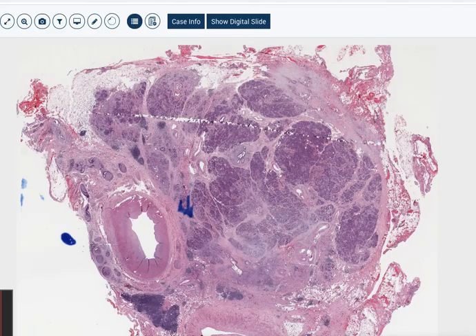So we're going to stick with the pancreas for a day or two. And here, as you can see, is a section of pancreas. We've got the splenic artery here, a nice thick-walled blood vessel. We've got a lobulated, multilobulated parenchyma. And in addition to these nice ink marks here denoting some abnormalities, we see there's some variability in the nature of the parenchyma. A lymph node over here, peripancreatic fat here, and so forth. But we see here's an area of some abnormality.